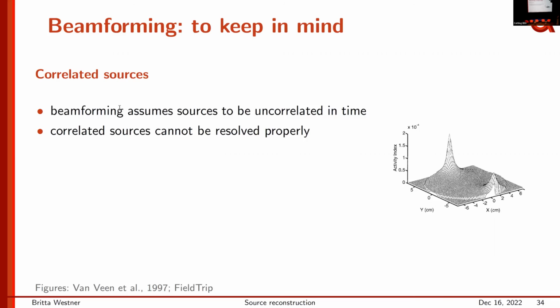There are algorithms that would give you really the gyri and sulci in your segmentation, and I have actually tried to work with that. If it comes to boundary element models, the problem is that you have the constraint that your boundaries cannot be intersecting with each other, and the likelihood of getting intersecting boundaries is way higher when you model all this curvature. So it is more realistic, but you buy another set of problems doing this.